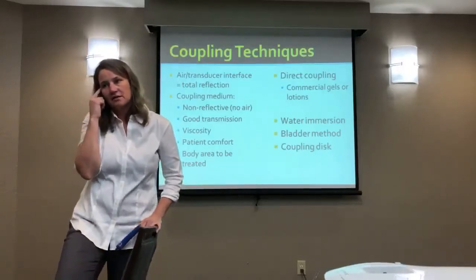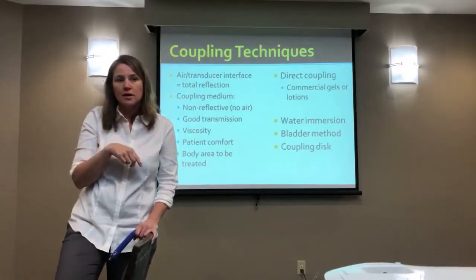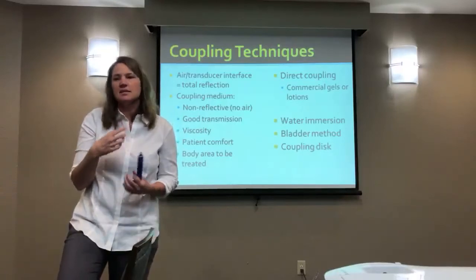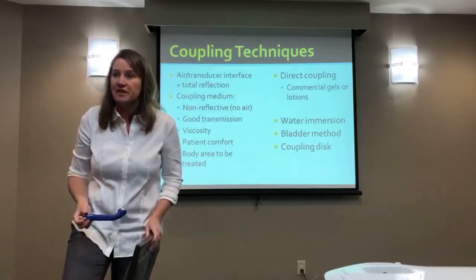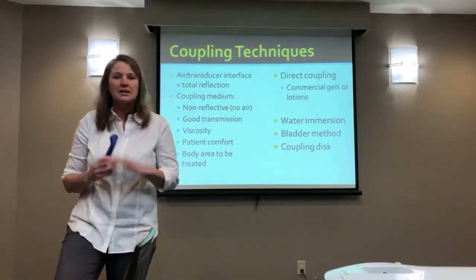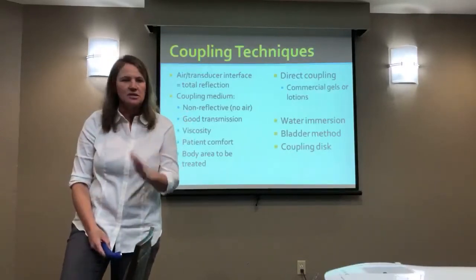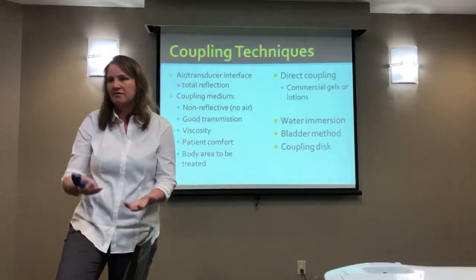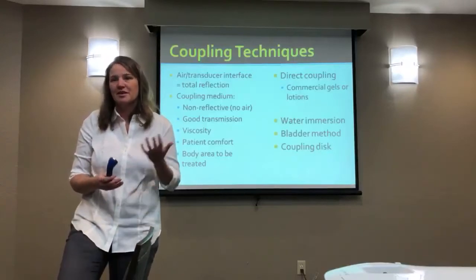Here's my thought. I could alter their sensation while I'm doing a modality that I need their sensation for. You know what I mean? So I take something that could maybe alter their sensation and they might not feel the heat I'm producing with the ultrasound. So in my mind, because I've debated this with people, I still stand that I wouldn't do it, because the one minute you save I don't think is worth the increased risk.